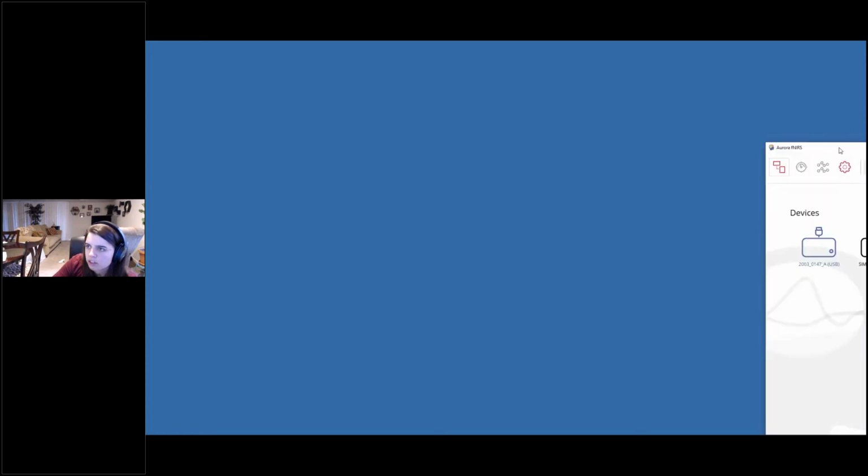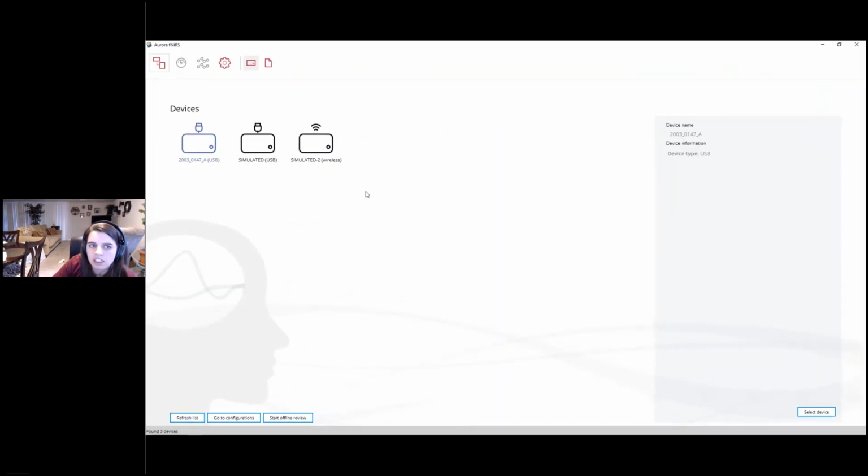Okay, so now I'll just show you here. I have my NIRx Port 2 device connected via USB cable, so I'm just going to put that off to the side. And let's see, I want to come to Aurora, and I'm going to select my device here.